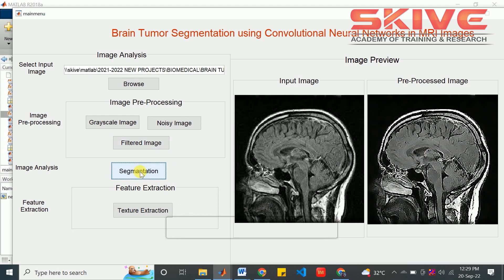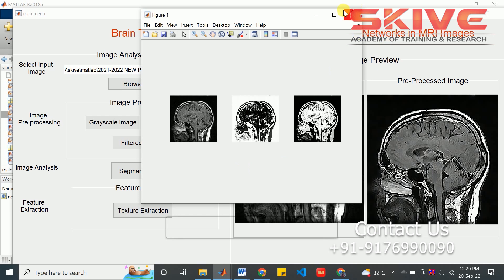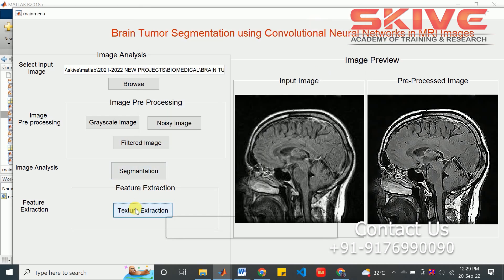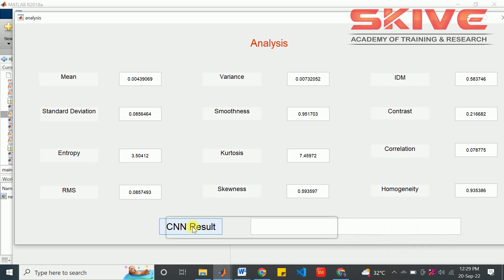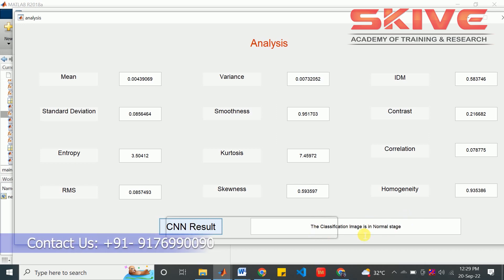After that, the segmentation will be applied. Then we are going to extract the features. This will give you the details of the analysis. These are some parameters for the extraction. Now we have to analyze the CNN result. The classification image is in normal state, so the patient is not affected by the tumor.